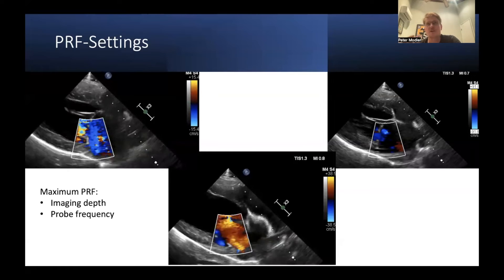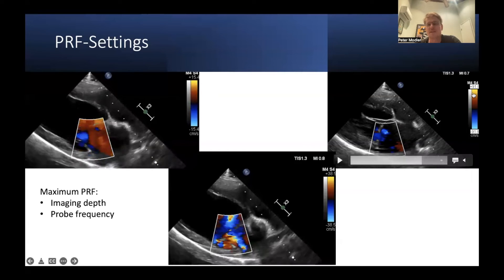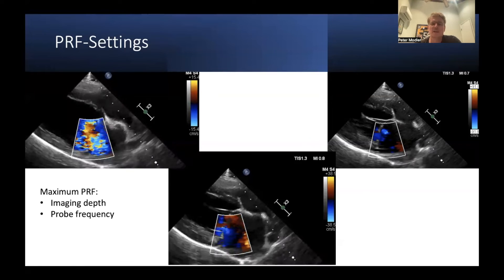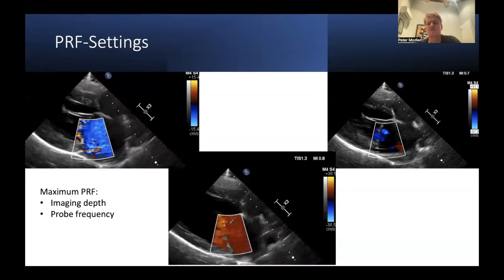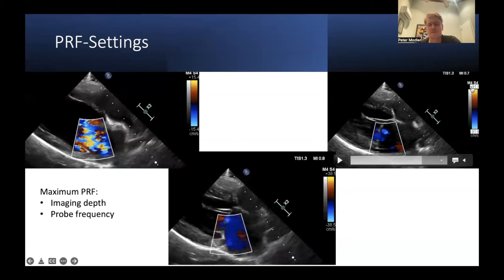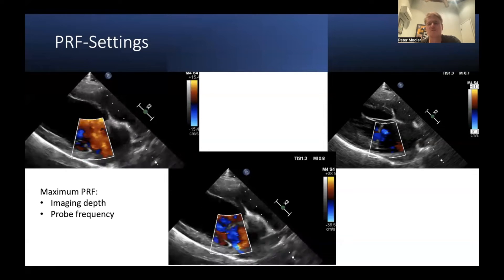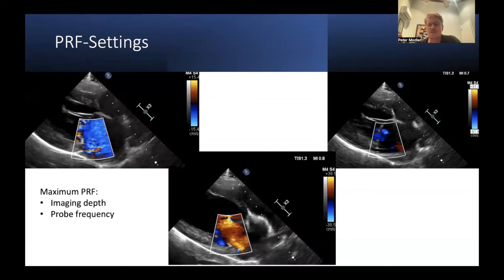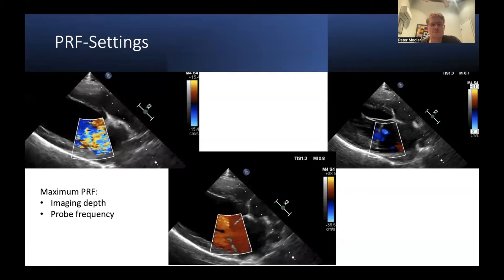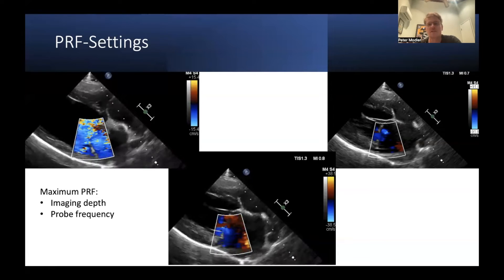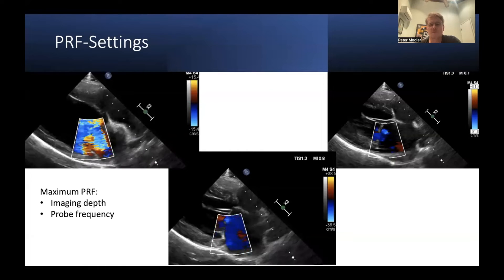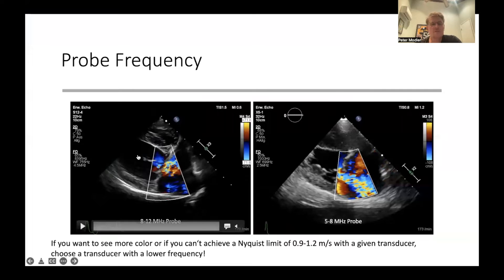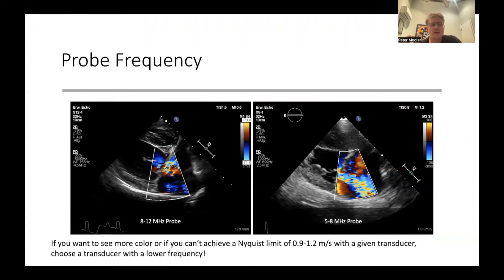Sometimes you can't turn up the PRF enough to achieve a high Nyquist limit. This happens if you're using a high-frequency transducer — for example, a 10 MHz transducer in a Great Dane will make it very hard to achieve a Nyquist limit of 0.9 meters per second, whereas the same transducer in a cat would be much easier. The Nyquist limit depends on your PRF setting, the frequency of your probe, and the imaging depth. If you want to achieve a high Nyquist limit in a Great Dane, you must use a very low-frequency transducer.